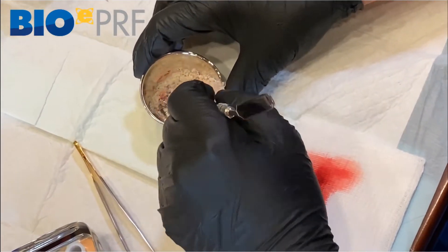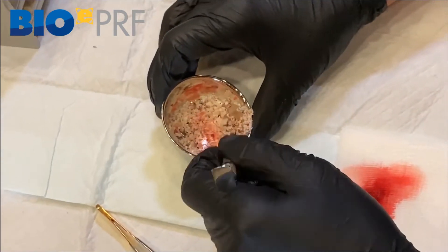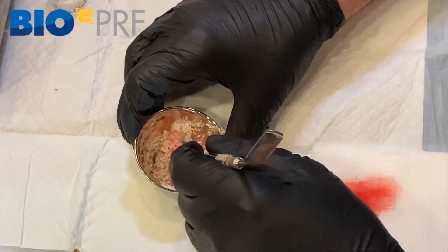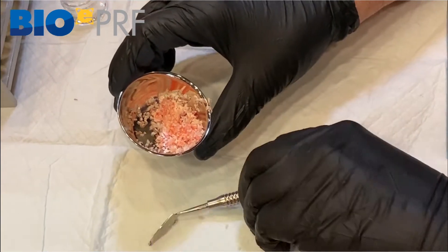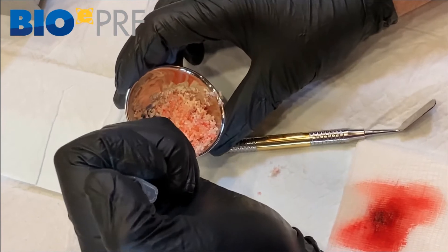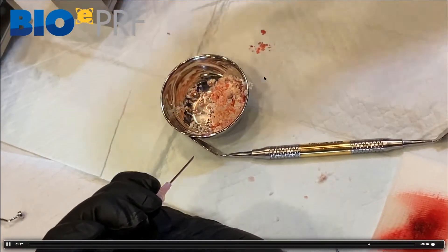If the bone graft has collagen incorporation, such as an allograft, it will typically allow that fibrin clot to form a little bit better. That's another important and quite interesting point. Now that we have the PRF — typically we cut up two PRF membranes per one cc of allograft — here I'm making a bigger sticky bone, so there's quite a lot.